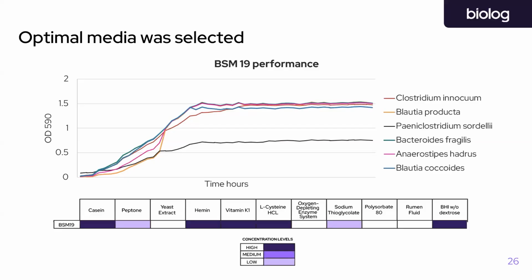Can we use Biolog synthetic media for other applications than the Biolog plates? Yes, absolutely. Biolog synthetic media would be compatible with metabolomics assays and would be an excellent source to first grow your cells and then use them in assays provided by different vendors for whatever activity in particular you're looking for. So this could be a metabolomics assay where you're looking for different postbiotic molecules like short chain fatty acids being produced. This would be very straightforward and highly compatible with that use case.